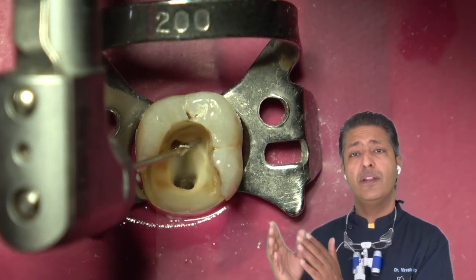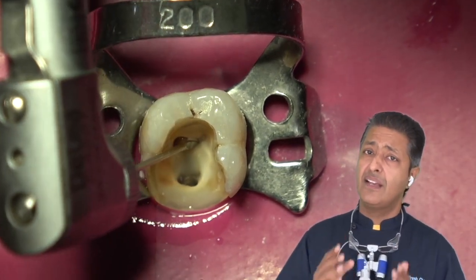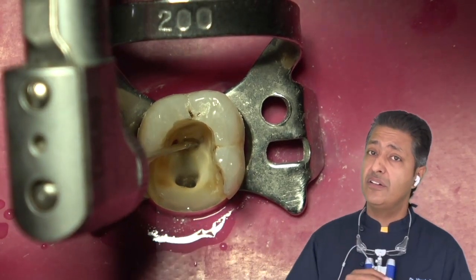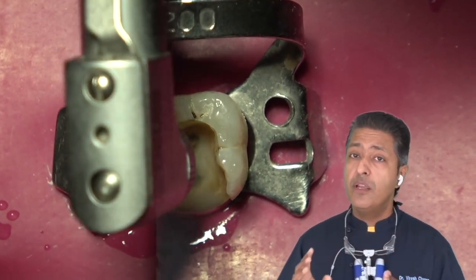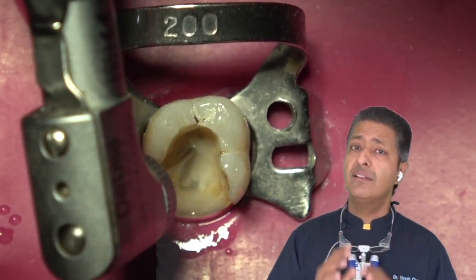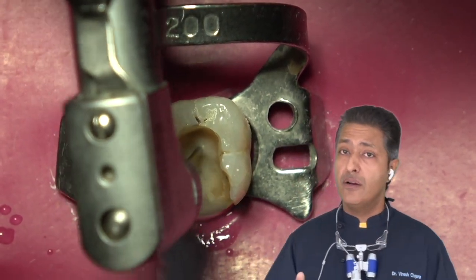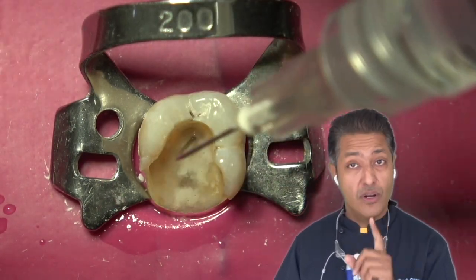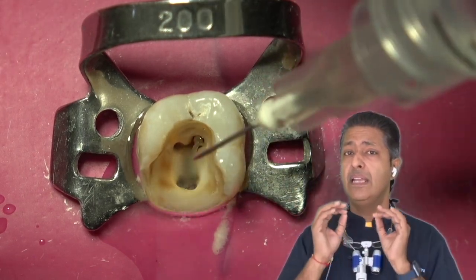Same protocol we need to follow for the other canals, as you can see on the screen. The second mesial canal is being orifice widened right now, taking care that the Gates Glidden drill is not forced inside the canal, and at the same time we are only performing circular movements and inward to outside brushing movements. Once these movements are done, the orifice is widened enough in order to receive the next instrument, but only after irrigation. Do not ignore the irrigation step.